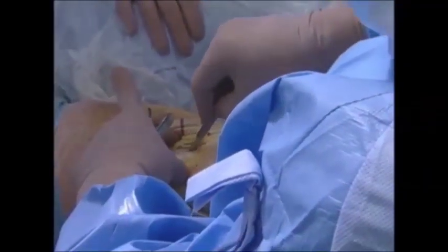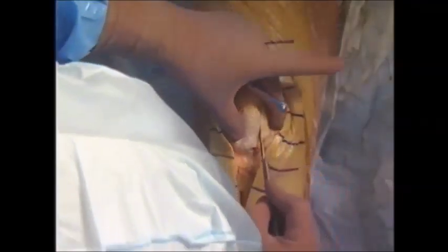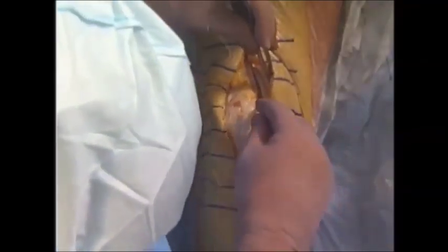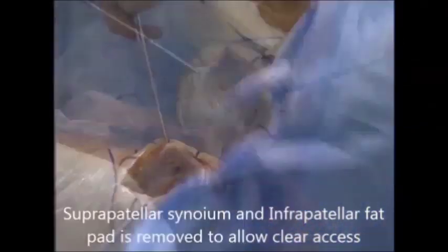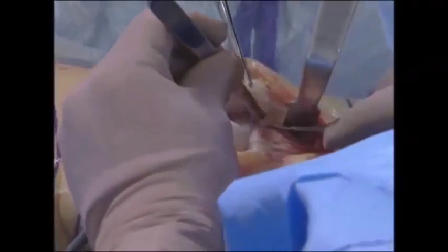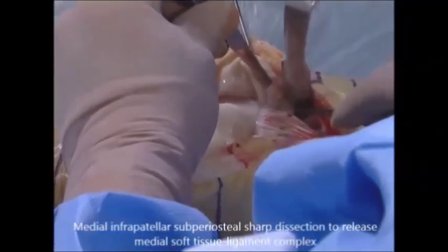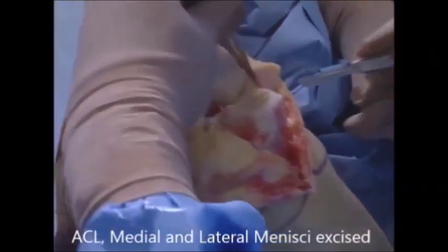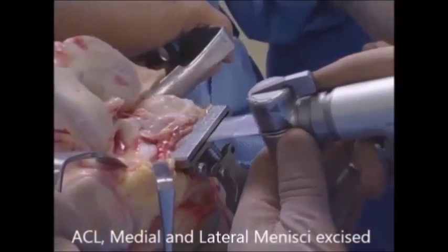Surgery starts with a vertical midline incision about 15 to 20 centimeters long. Suprapatellar bursa and infrapatellar fat pad are partially excised to allow better access or to improve the exposure. Intra-articular ligaments and menisci are excised. Medial subperiosteal sharp dissection helps in correcting the varus deformity and thus helps in aligning the knee joint in the best anatomical position.